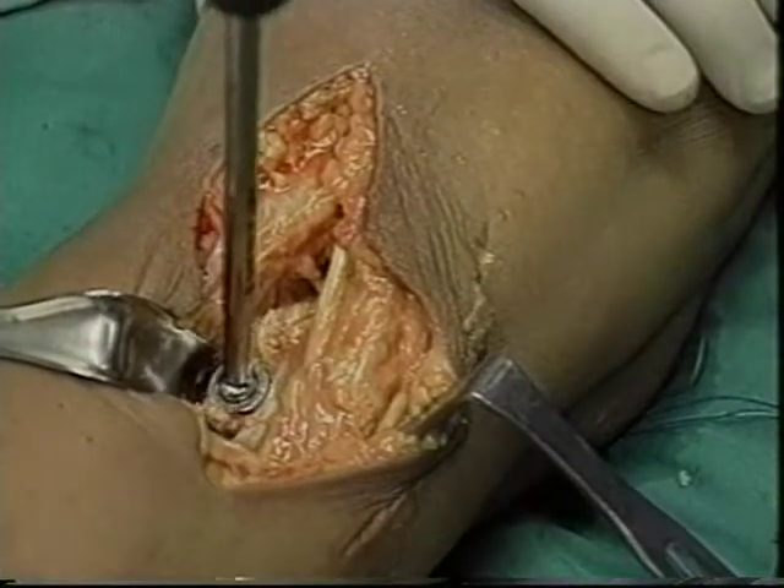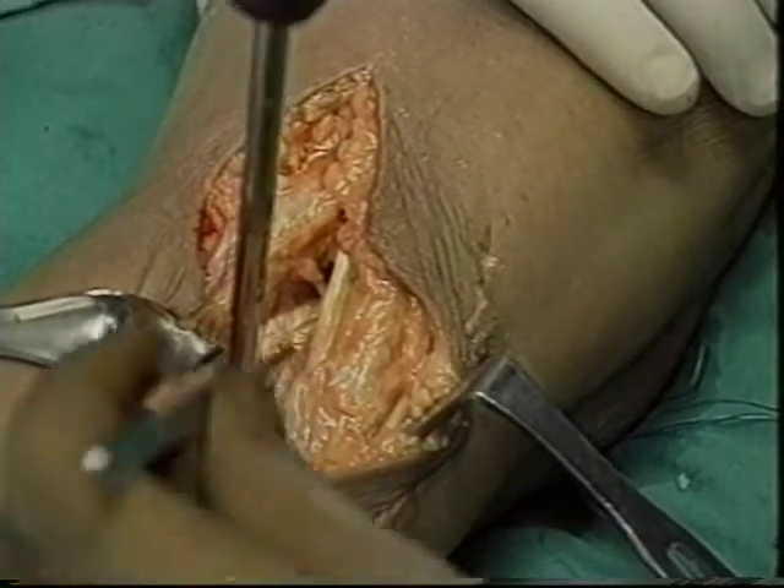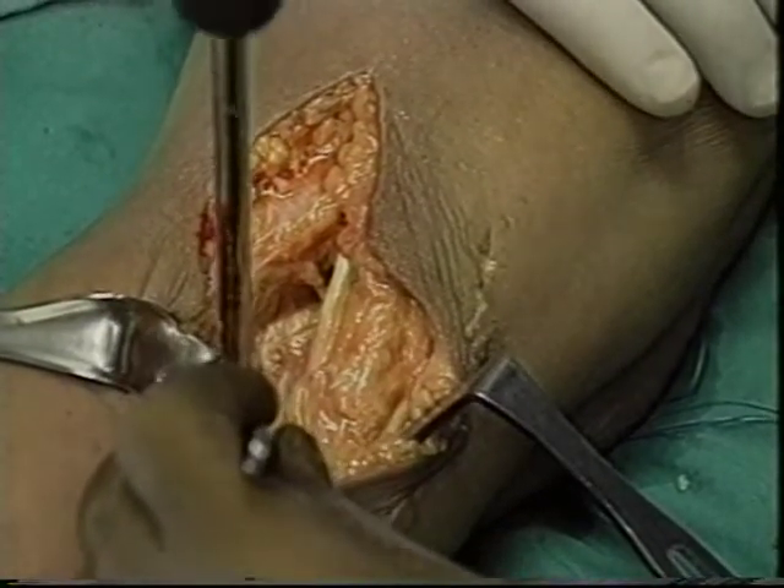With the graft bone plug fixed in its anatomic position on the tibia, the graft can be tensioned from the front on the femoral side.